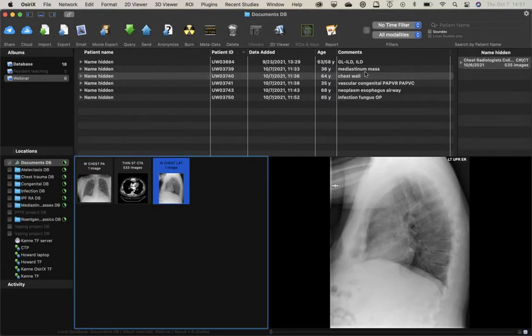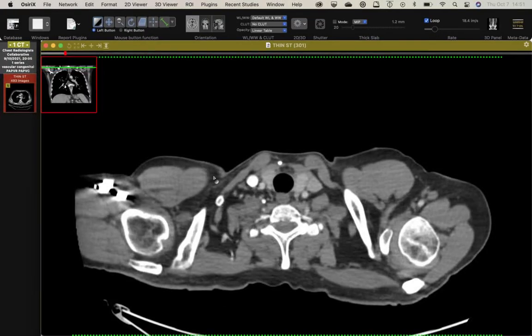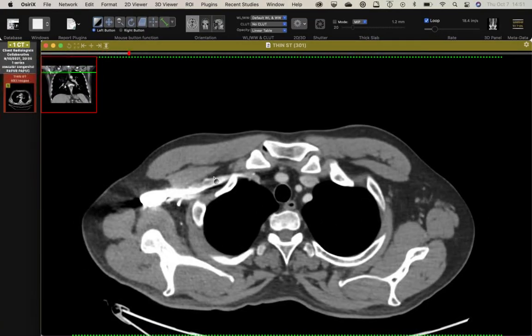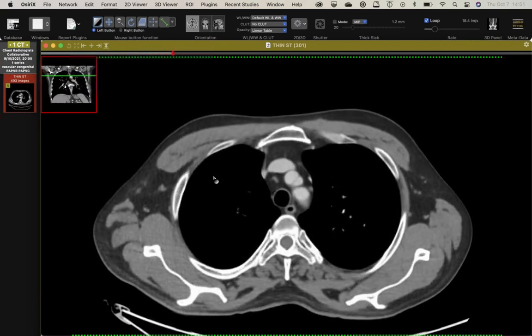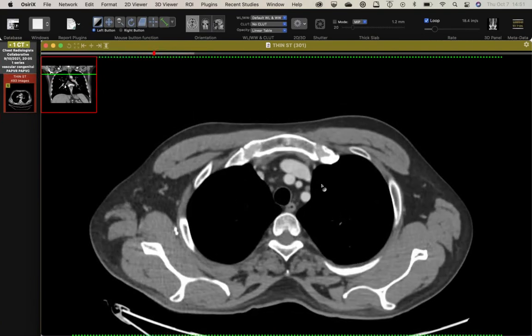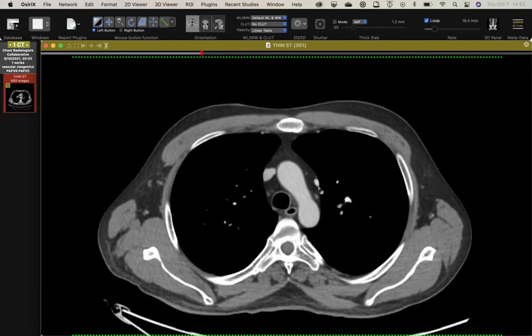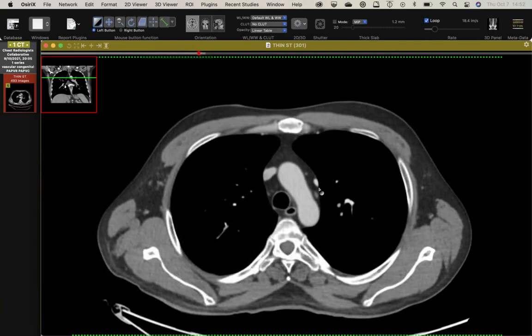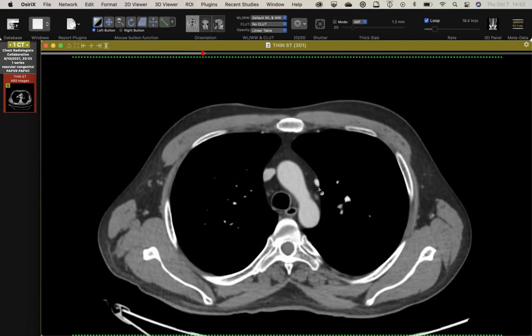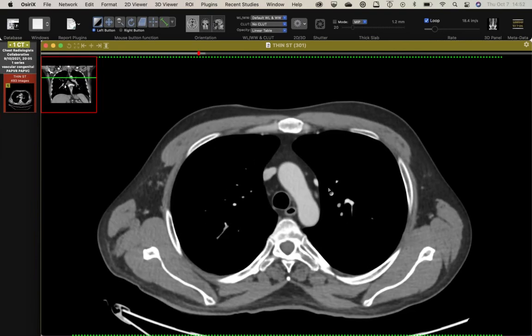Okay, this is kind of a cute little case I came across the other day, and I found an old study that shows it better. So, an incidental finding of a really tiny vessel running lateral to the aortic arch. And one of the rules I teach my residents is there should never be a vertical vessel here. If there is, it's either a left SVC draining down, or it is a partial anomalous venous drainage draining up.